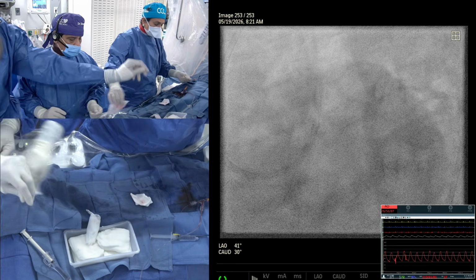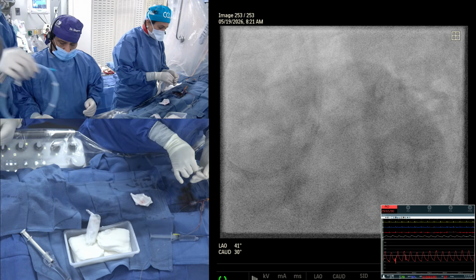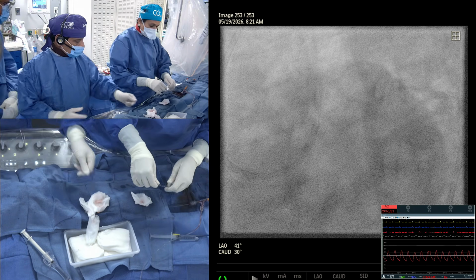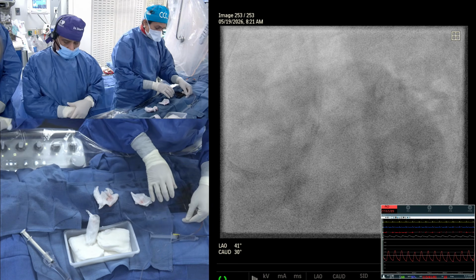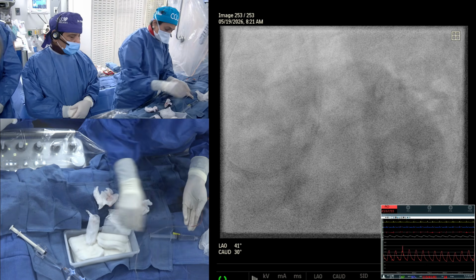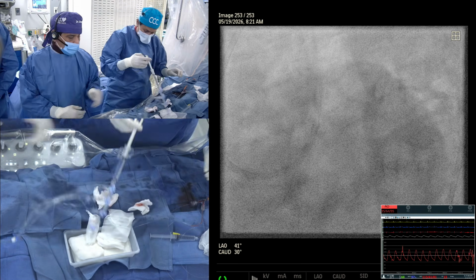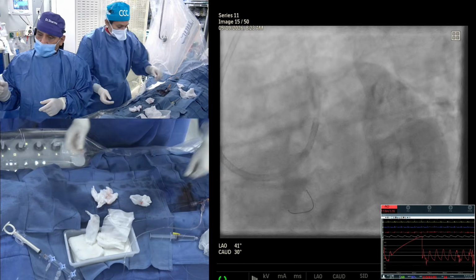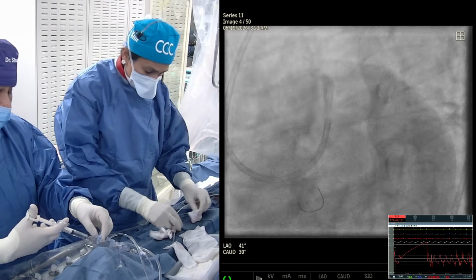True ostial disease of the RCA, where your guide is actually not in the vessel, where I call it zip lining. Zip lining rota. It's called that where you have the guide not engaged, you're far away, and rota has to go on the wire without engaging the guide in the vessel. So that we call zip lining. And in that situation, yes, you need extra support, definitely extra support. So a very simple answer would be that, as Anu mentioned, in aorto-ostial, extra support is reasonable. In non-aorto-ostial, I think it should be floppy because extra support can cause significant wire bias in one way versus the other.